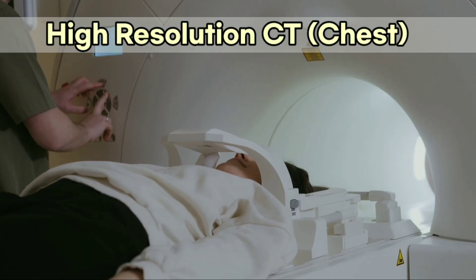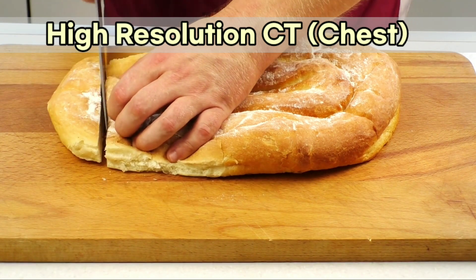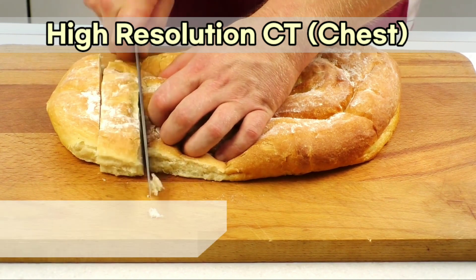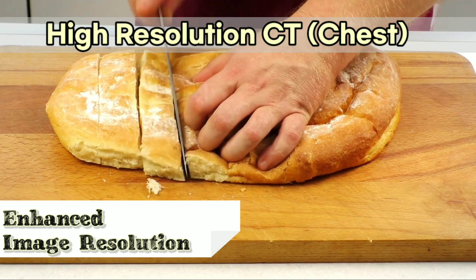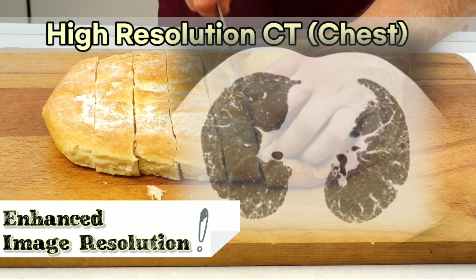HRCT uses a narrow beam collimation to make thin slices of the lung parenchyma in axial sections with high resolution.